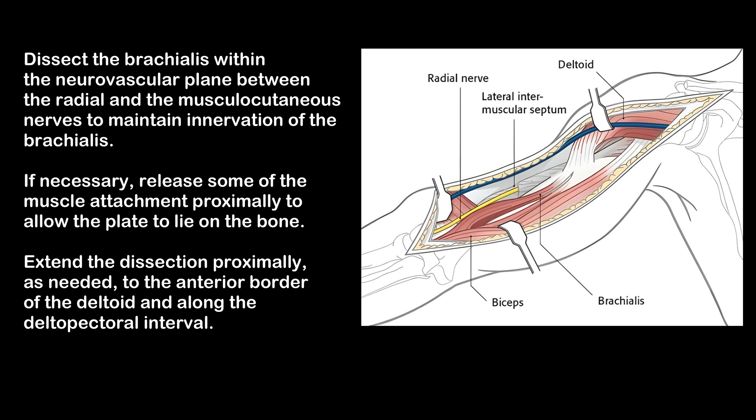If necessary, release some of the muscle attachment proximally to allow the plate to lie on the bone. Extend the dissection proximally, as needed, to the anterior border of the deltoid and along the deltopectoral interval.